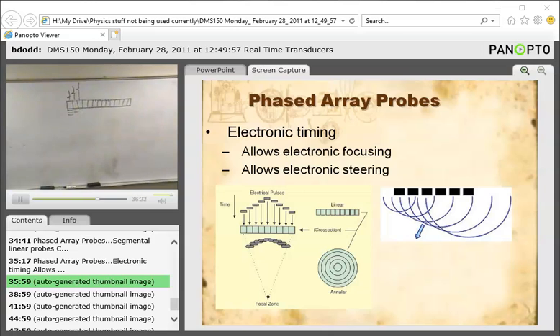Let's fire off one more at a little bit later time. This one's still going into the body. This one now comes down a little bit. This one has gone a little ways. And now this one fires. Now let's not fire anymore for a couple of microseconds. We're going to let these travel down into the body just so we can describe what they're doing a little easier. It looks like that.